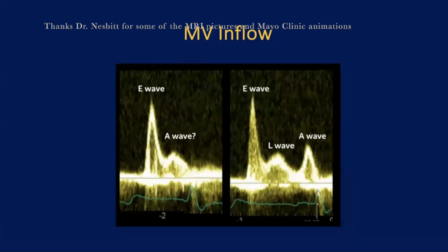It represents elevated pressures, generally a high LA pressure. That's diastolic dysfunction, which is a differential. Yeah. So just to repeat, it means usually elevated left atrial pressure, often associated with diastolic dysfunction, and it's also known as the Batman sign. So you have to look at just about here, the 2 ears and then the head. So that's known as the Batman sign.